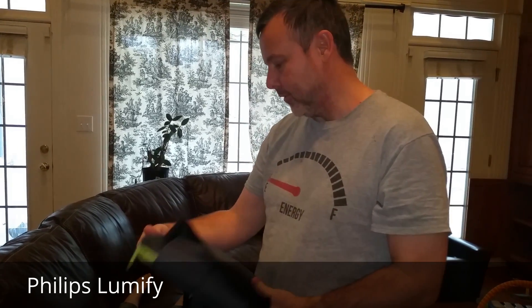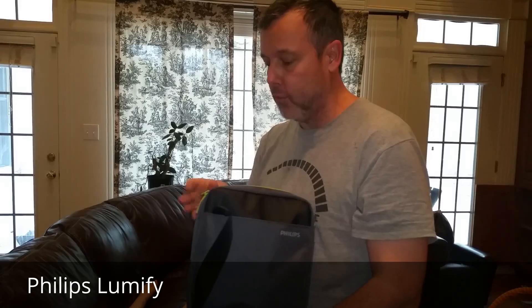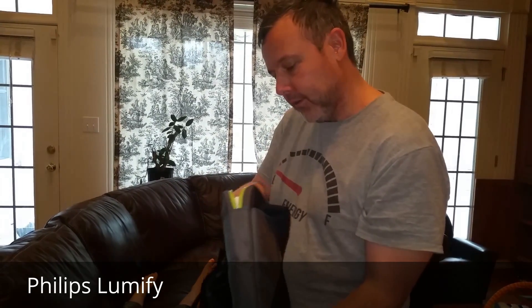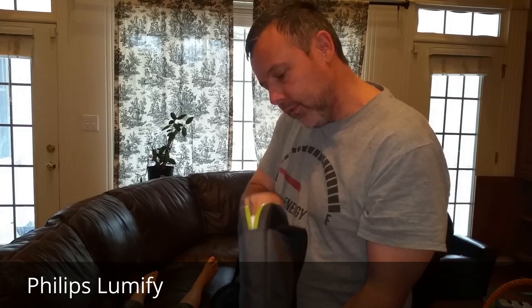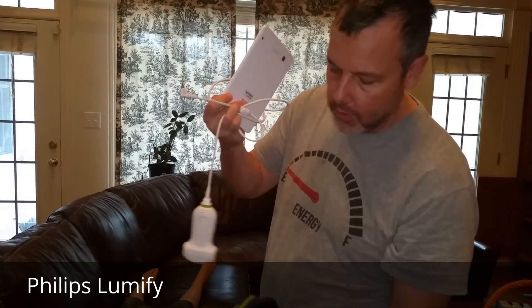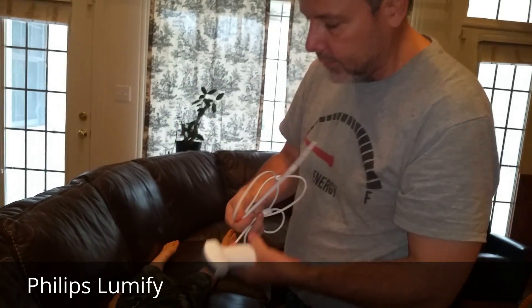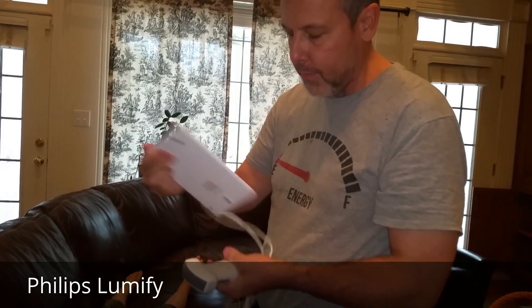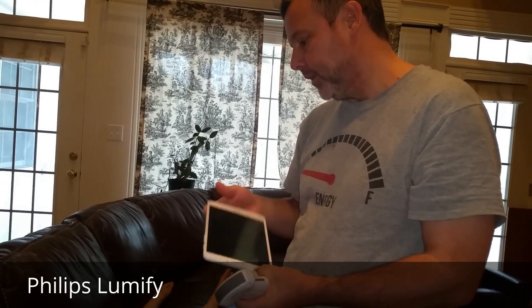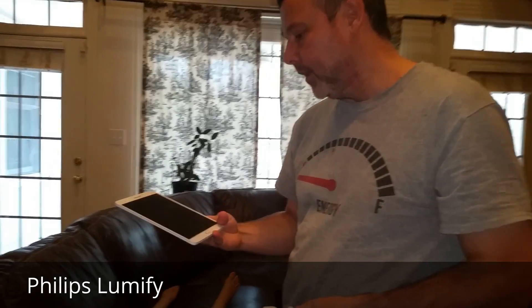Hi there folks, I'm showing off the Philips Lumify Portable Ultrasound system that's relatively new to the market. Philips is unique in that they are leasing this product, so there's pretty minimal overhead investment. Essentially what they've done is included the entire ultrasound package as part of the probe itself, and then you as the end user simply get your own tablet.